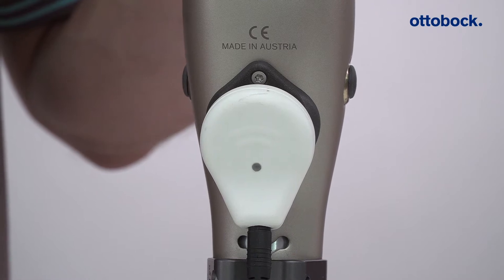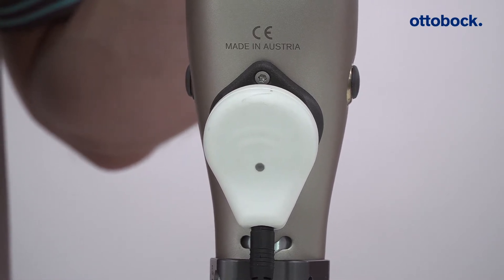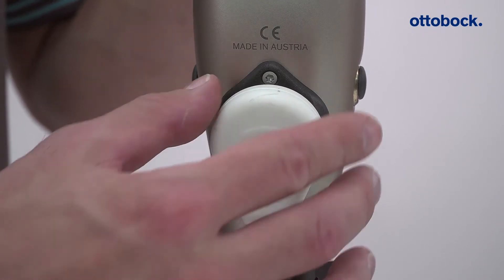The knee joint performs a self test after the charger is removed. Hold the joint still until the single beep and vibration signal confirms that the self test has been successfully completed.